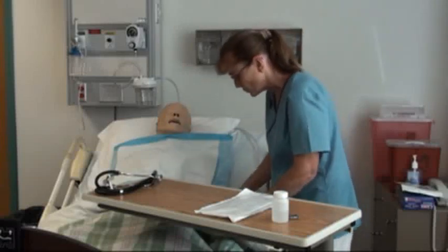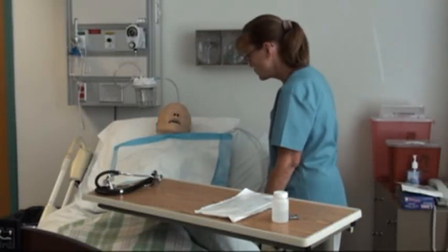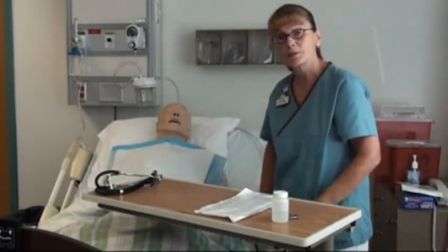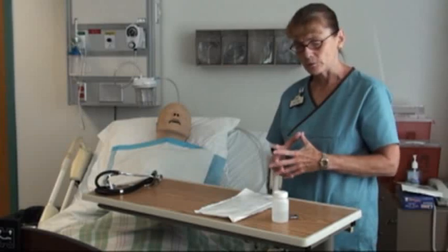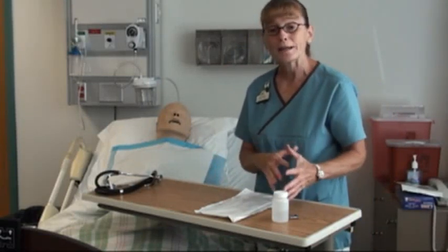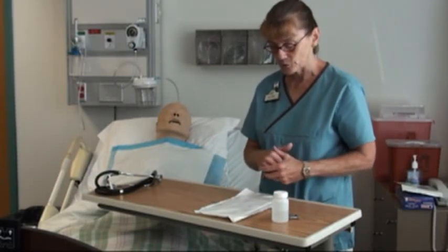Once we come in the room, you want to identify your resident — Mrs. Johnson — and explain who you are and what you're here to do. She's in agreement with it, and we've established a means of communication. While I'm actually doing it, she'll tap on the bed. I'll also provide privacy. If you feel the need to wash your hands again after gathering the equipment, please feel free to do so.